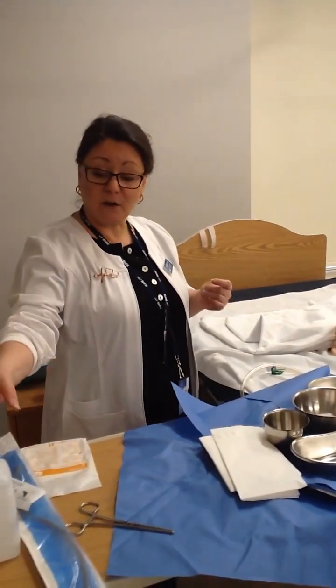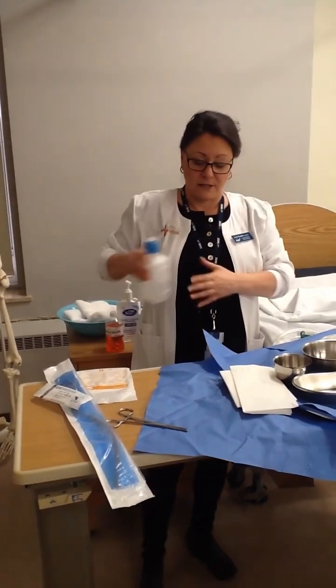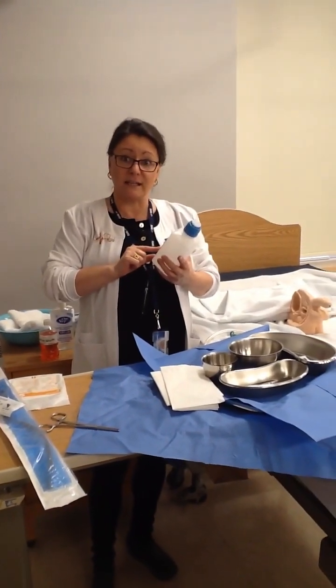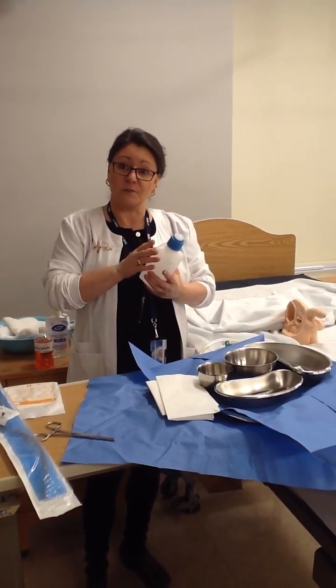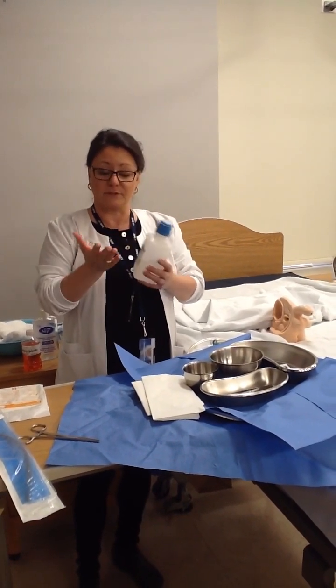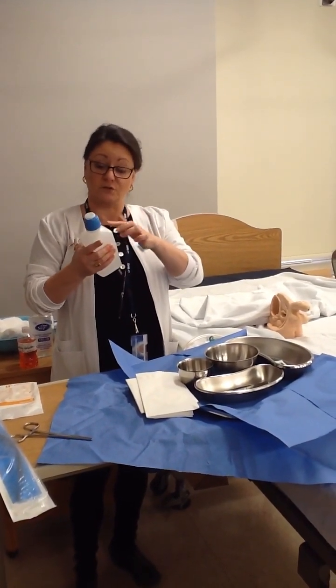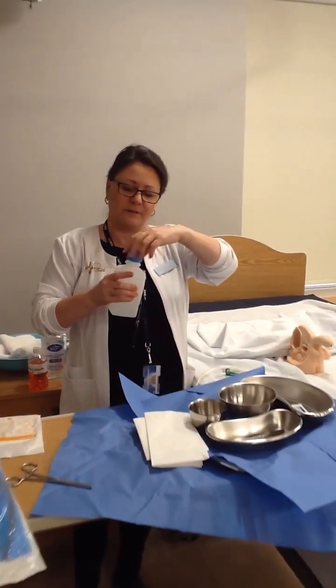Next I'm going to add my sterile water. Again, I'm going to reach away from my tray. I'm checking the label and the expiry date. It's been opened before because I can see where the nurse before me initialed and dated, the same as the cleansing solution. I'm moving the label to my palm so that I don't drip and mar the label. And I'm going to take the cover off, and I'm holding it.